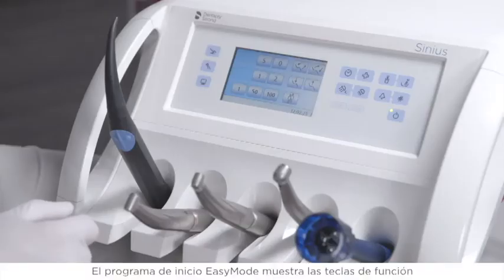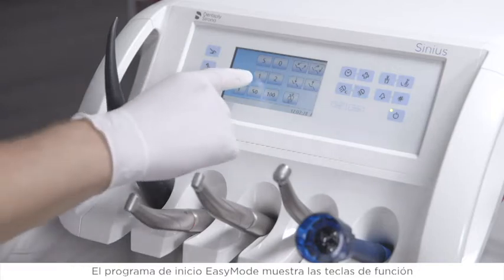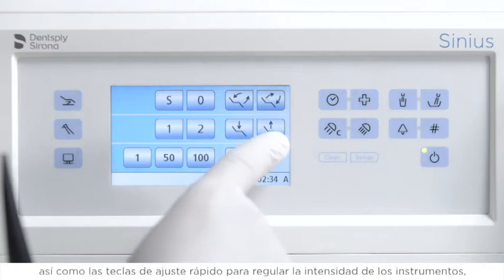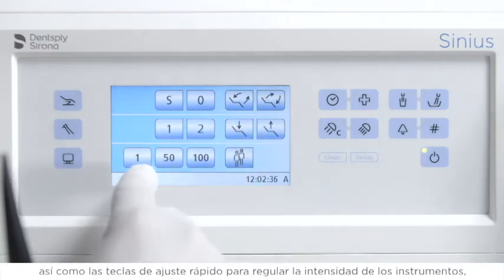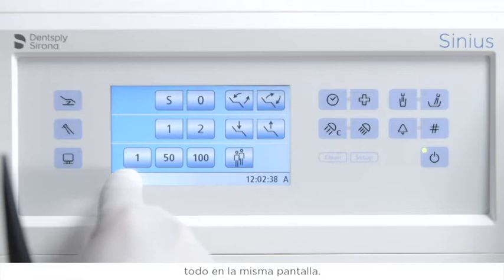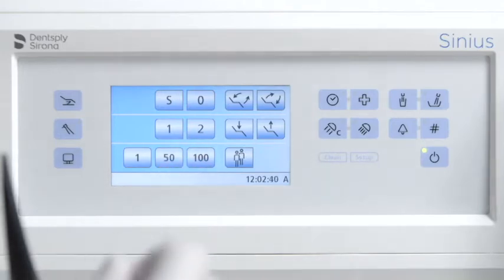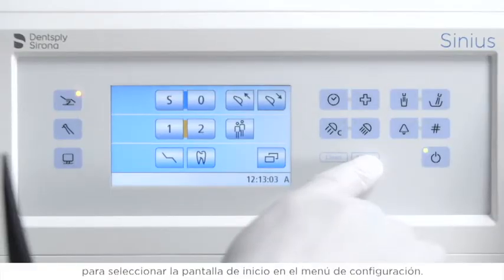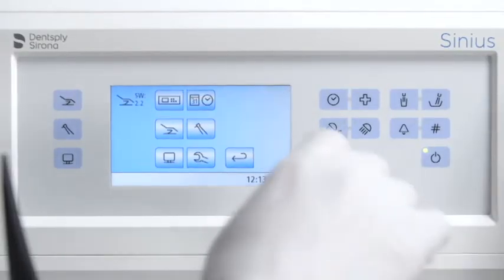The Easy Mode Start program displays the function keys for the patient chair programs and manual chair adjustment, as well as the quick setting keys for adjusting the intensity of the instruments together on the same screen. Press and hold the Setup button to select the Start screen in the Settings menu.